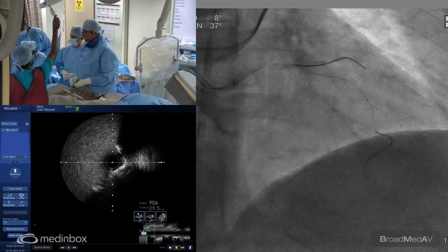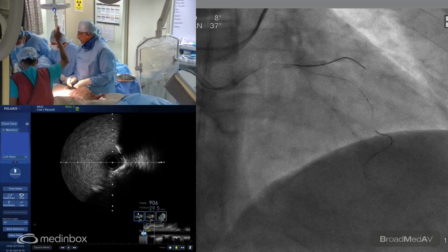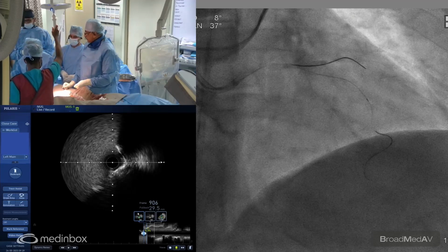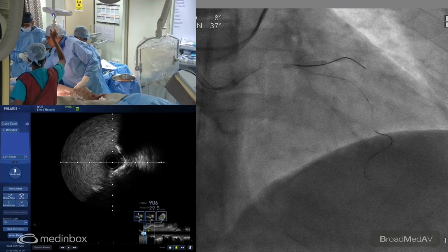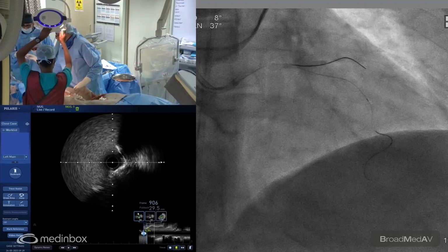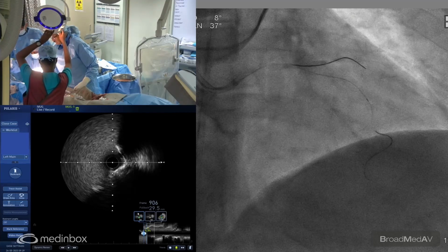Lights. And we now put the catheter into the power source. So the power source is ready. Okay. And we keep the balloon here. And you can move the IVUS out of the way, please, sister.